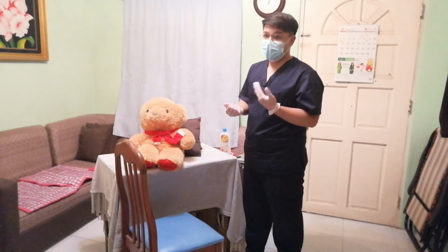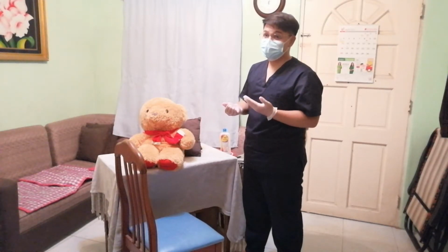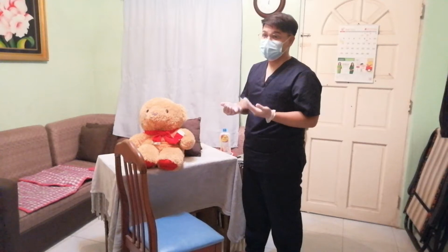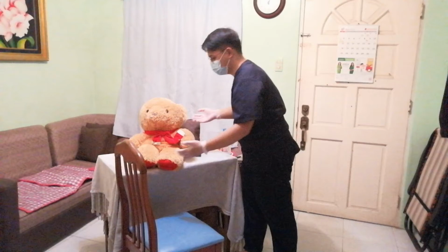After that, we will again encourage our patient to make use of the stand assist device, and we need to assist the patient to a sitting position on the side of the bed, and also ask the patient to swing his or her legs over the side of the bed.